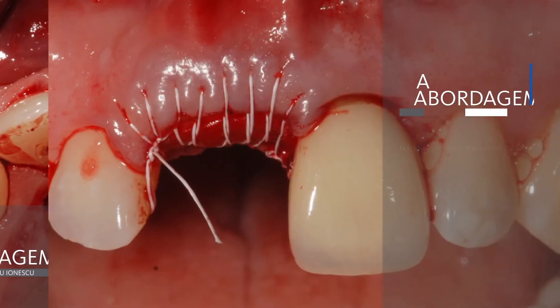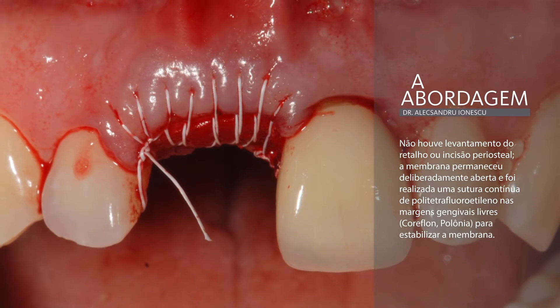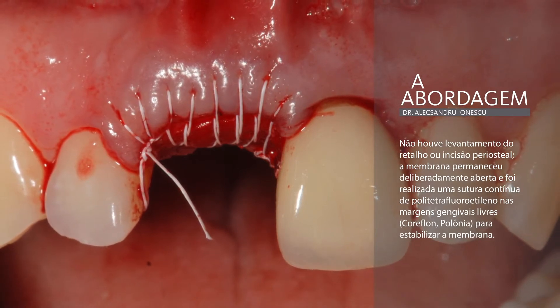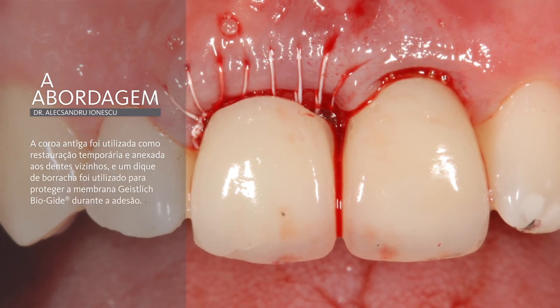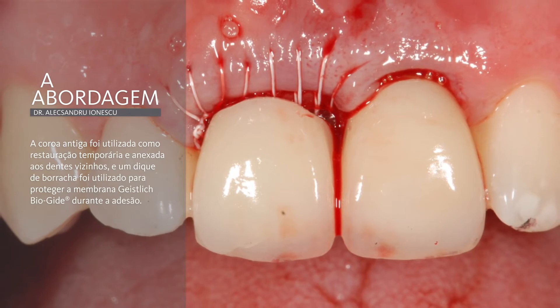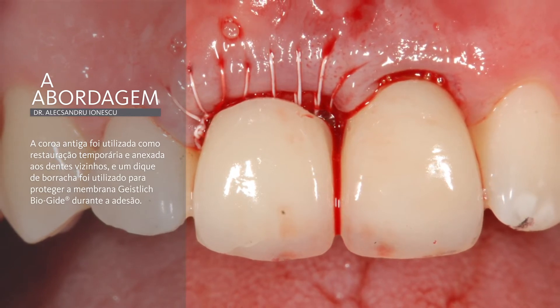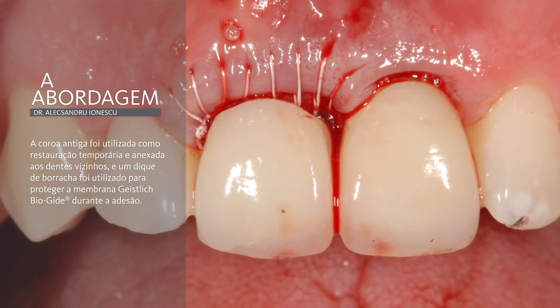This is the clinical view showing that no incisions were made, so there will be no scars and the fixed gingiva will be preserved. A provisional crown was attached to the adjacent teeth. Rubber dam was used to protect the open healing site during the adhesion procedure. A functional check was performed to respect functional movement and avoid any interferences that can generate forces on the provisional.